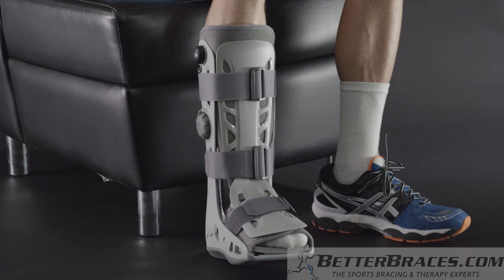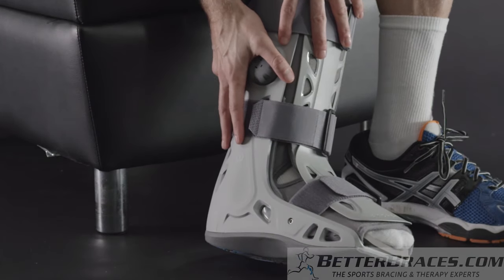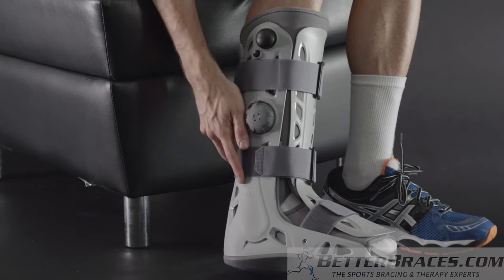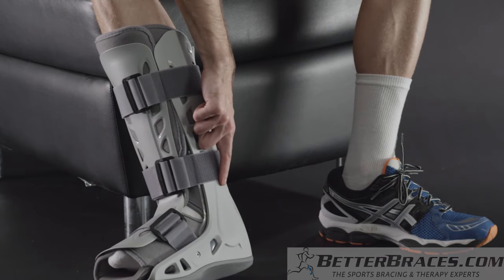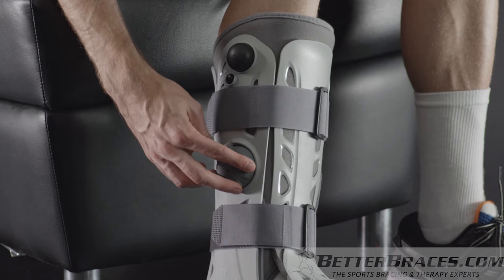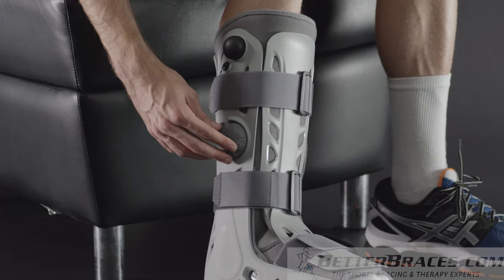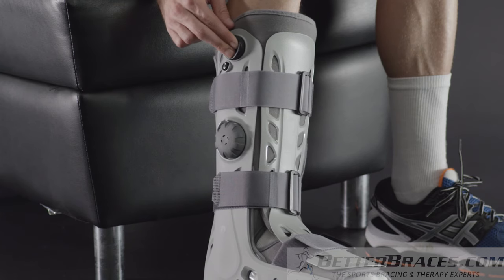To adjust the AirSelect Standard for a proper fit, you'll need to inflate the air cells. Begin on the injured side of your leg by locating the number on that side of the boot. To inflate each air cell, turn the selector on the right side of the boot to the appropriate number. Number one inflates the air cell on the right side, and number two inflates the air cell on the left side. Once you've turned the selector to the appropriate air cell number, press and release the large inflation pump on the top right side of the boot. Pump until the air cell feels snug, but not overly tight. To inflate the other air cell, rotate the selector to the appropriate number, and then press and release the large inflation pump.